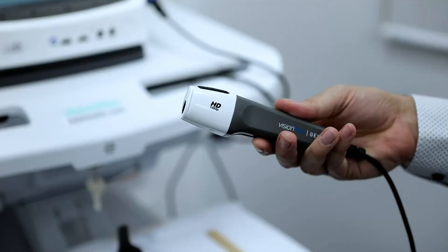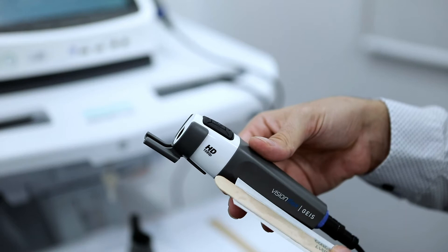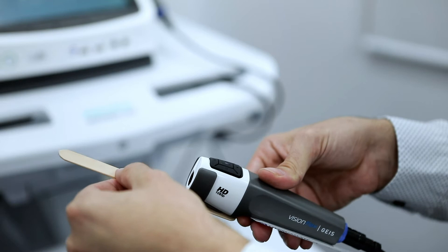To use either the tongue depressor or the wound measurement stick, first clip on the grey attachment to the front of the GEIS camera. The attachment is supplied in the GEIS camera kit. Then unpackage a sterile tongue depressor and slide it into the attachment to perform oral examinations.